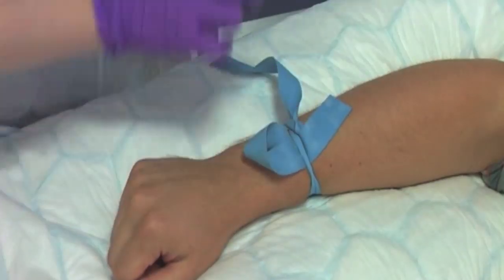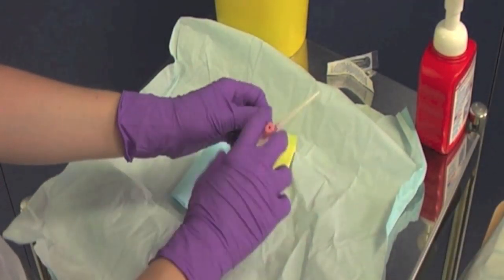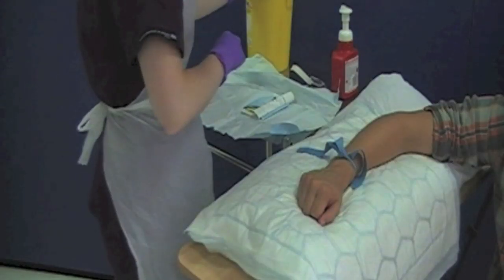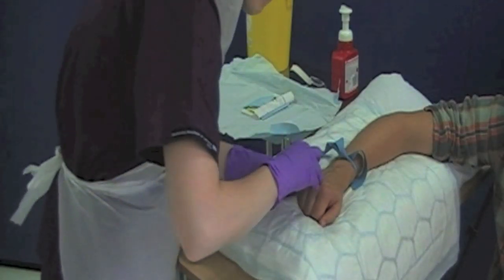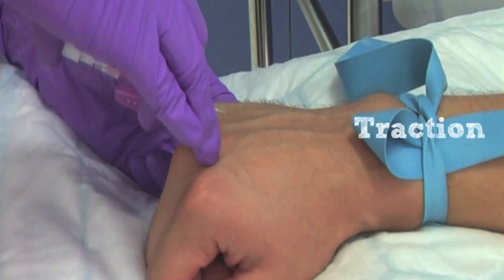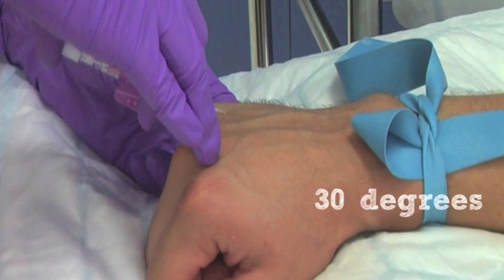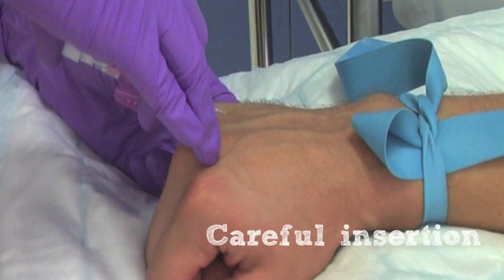Take the cannula and fold the wings flat. Remove the sheath from the needle and place in the sharps bin. Your fingers must not touch the needle. Apply traction below and to the side of the proposed puncture site to help immobilize the vein. Advance the needle, bevel up, into the vein at an angle of approximately 30 degrees. Care should be taken not to insert the needle so far that it continues through the vein and out the other side.